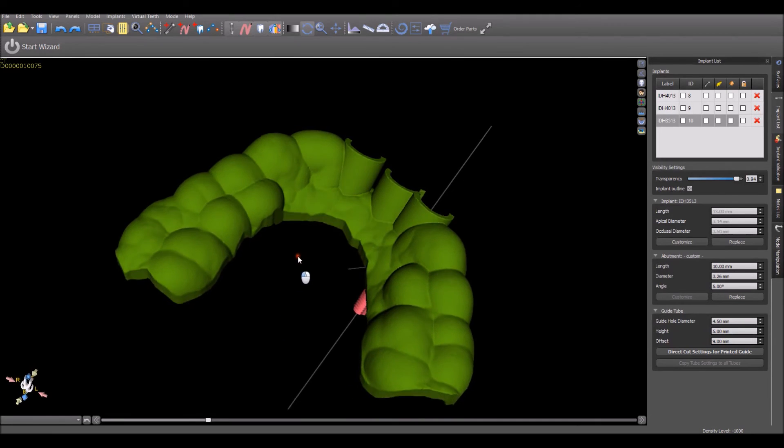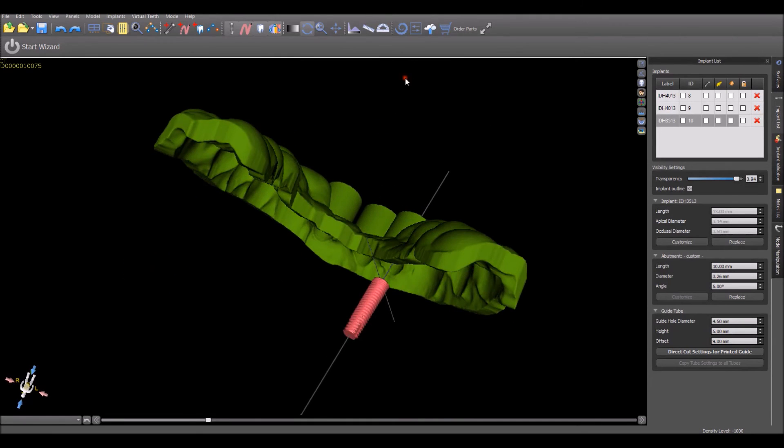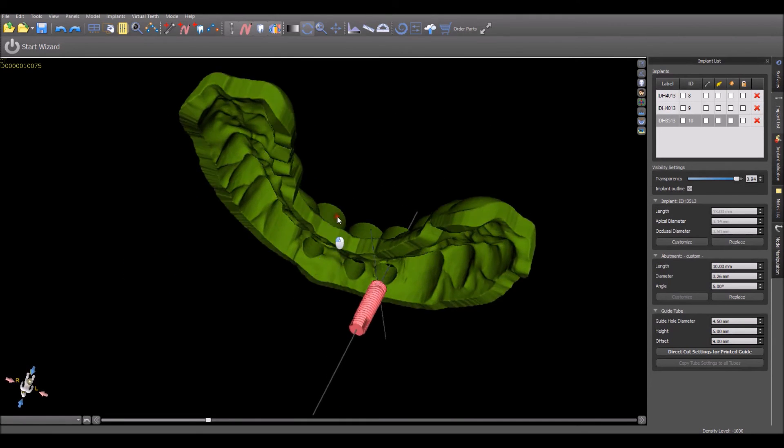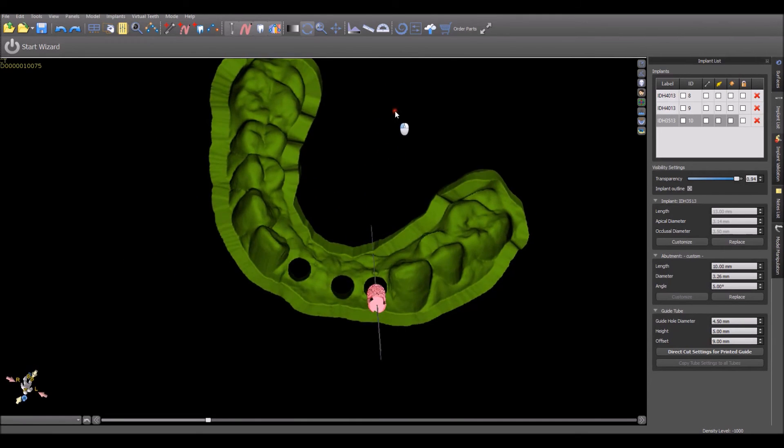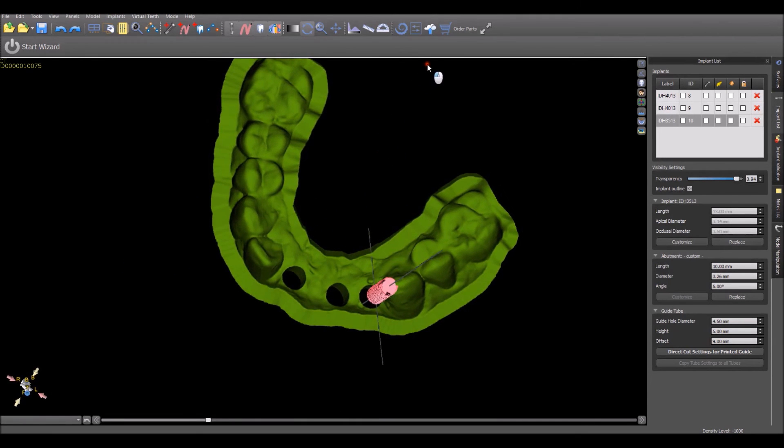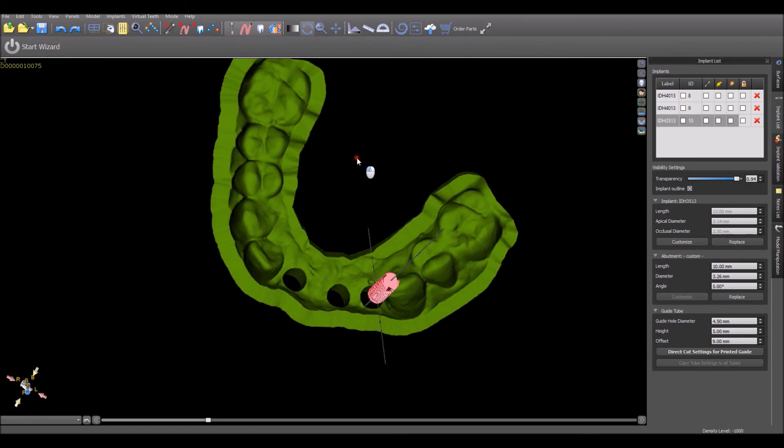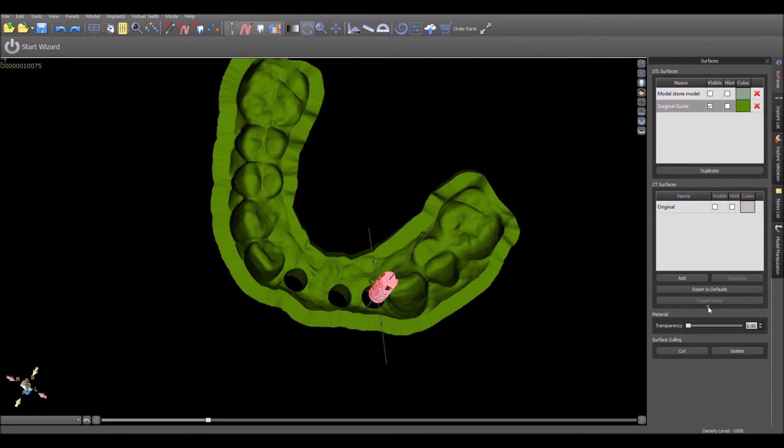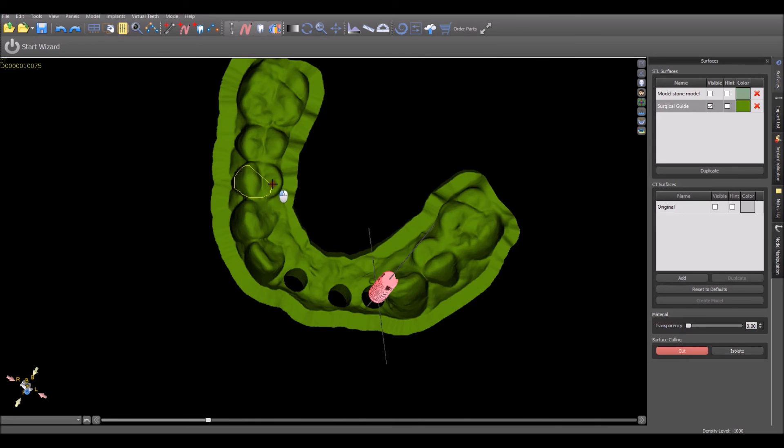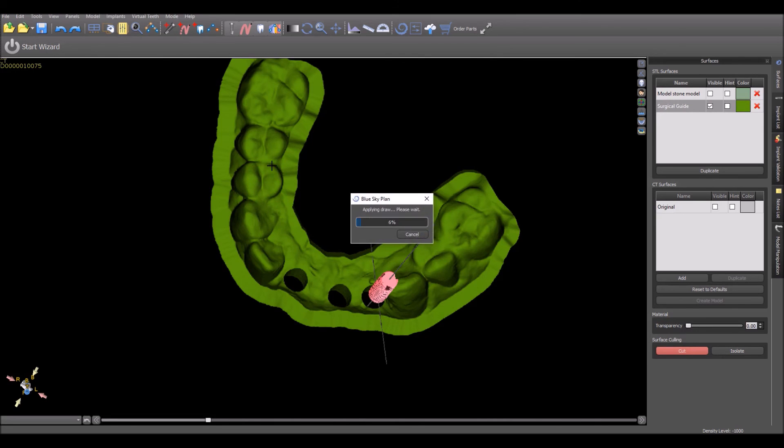Another option is to flip over the surgical guide, and once again cut from the inside out. Here, you'll have a higher level of accuracy, and you won't need to be concerned with many of the issues that we mentioned earlier.